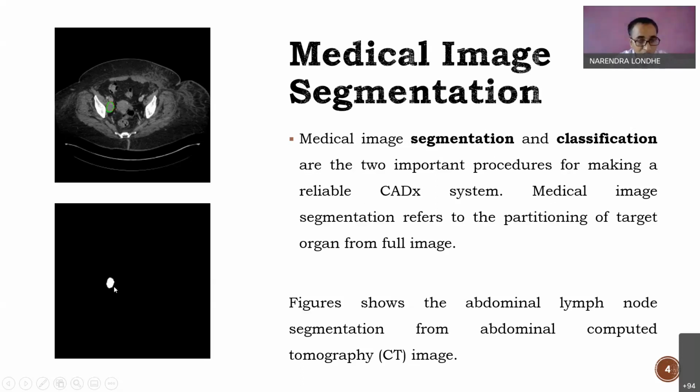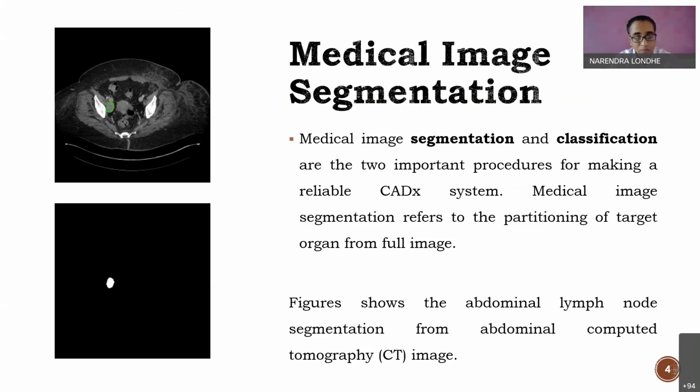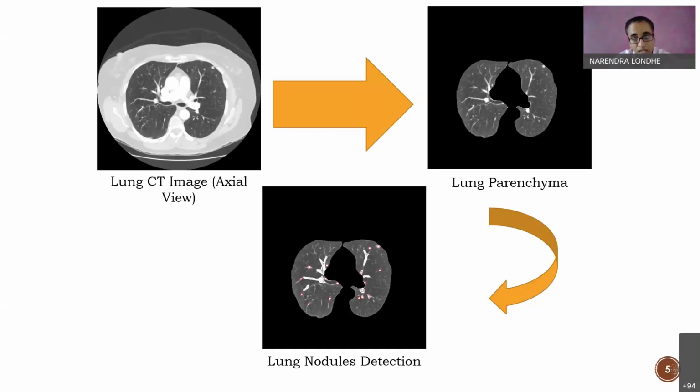With it, you can measure the size of the lymph node, or extract this lymph node from the image. You can check the intensity of the gray levels and decide something about the severity. If we do that, I will say it is a task of classification. We'll come to that, but let me give another example.